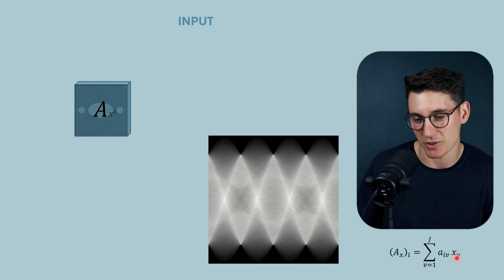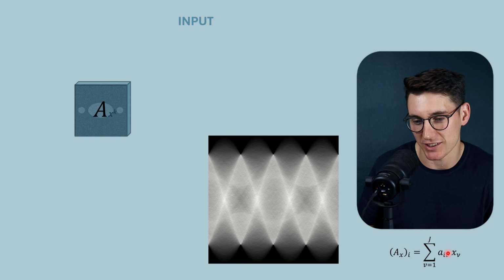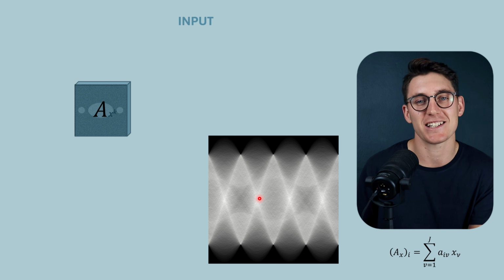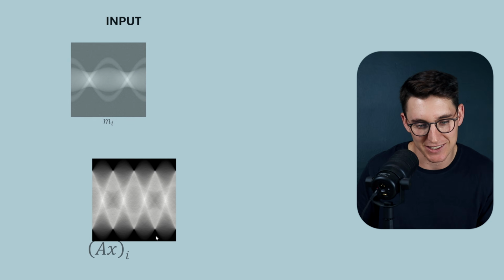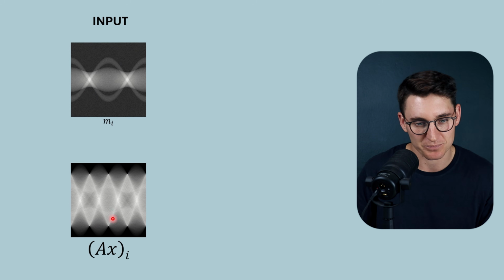It's our matrix-vector multiplication over all the detectors, over all the voxels that contribute to signal in one detector through our estimate image here. And we're going to add up all of those predicted values through all the voxels in the image. It's maybe a little bit out of the scope of the talk, but you'll see this come up later. So we've created a second sinogram that is a predicted sinogram based on the estimated image that we've created.